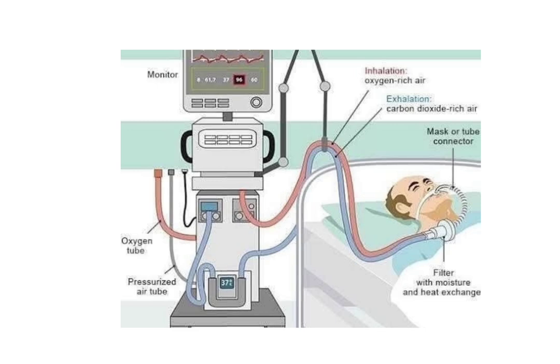The third setting is respiratory rate, or RR. This is the number of breaths the ventilator gives per minute. The fourth setting we have is PEEP, which stands for positive end expiratory pressure. It keeps the alveoli open after exhalation to improve oxygenation and prevent lung collapse. Finally, there's pressure support, or PS. This helps reduce the effort needed during spontaneous breathing, especially useful when weaning a patient off the ventilator.